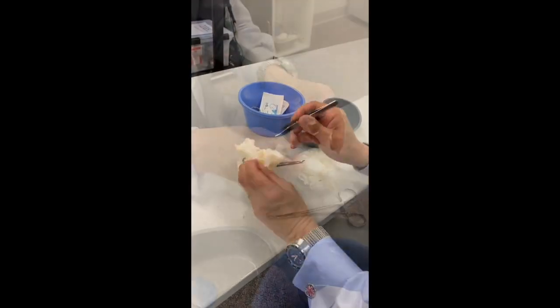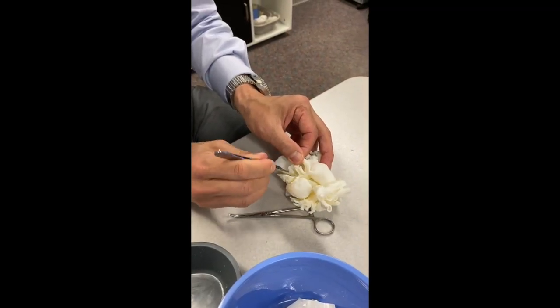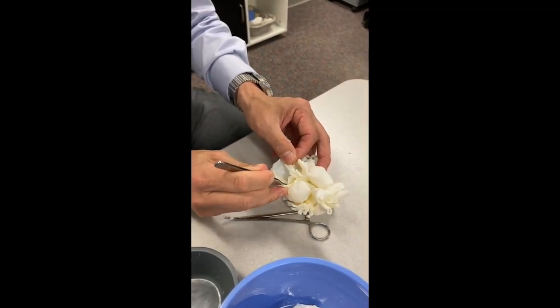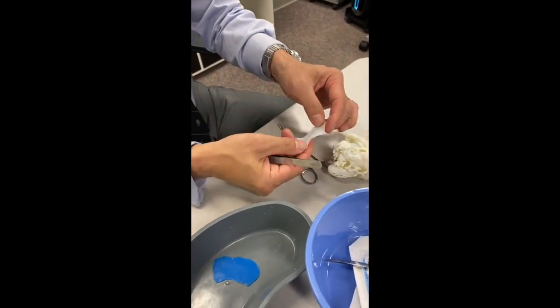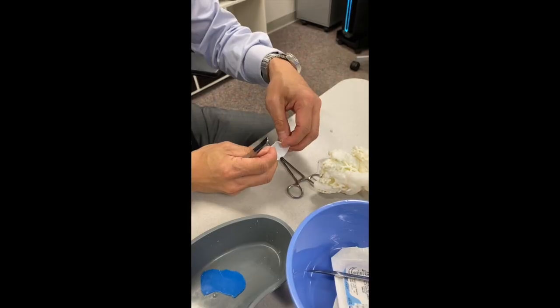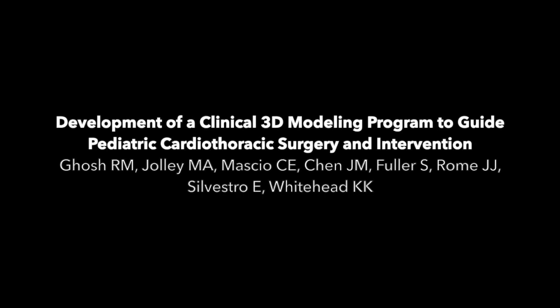In addition, the surgeon has the opportunity to preoperatively evaluate the size and shape of the patch needed for these most complex biventricular repairs. After creating more than 120 clinical models to date, we have learned that using complementary 3D visualization techniques can provide comprehensive procedural planning for patients with congenital heart disease.